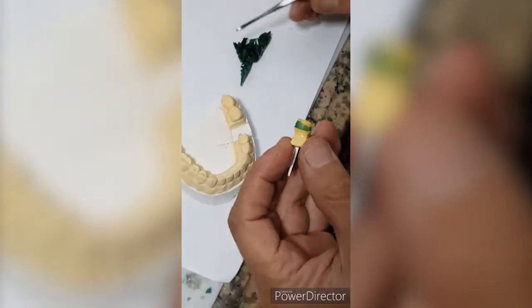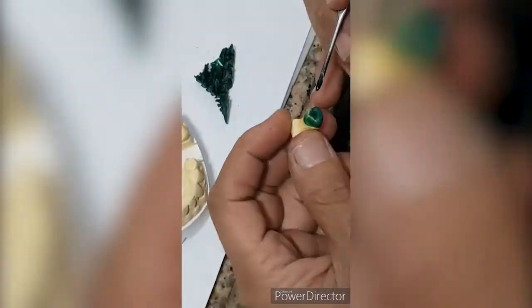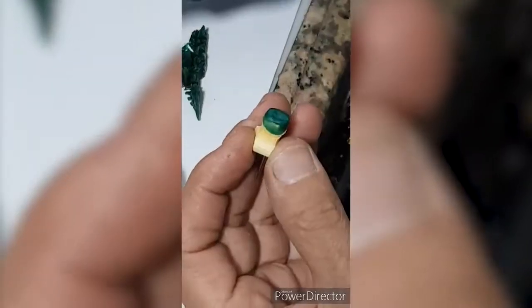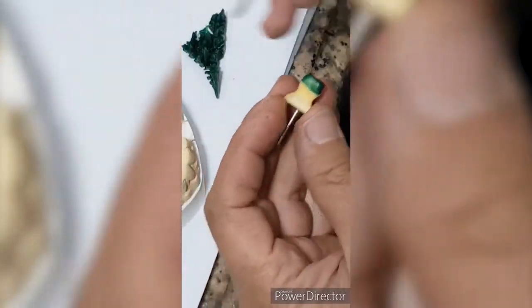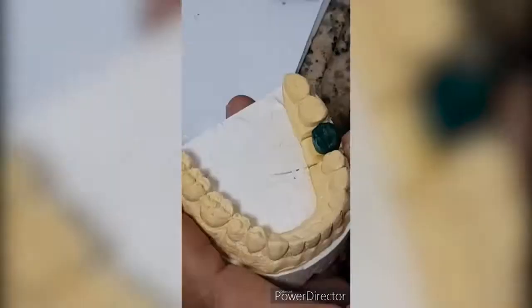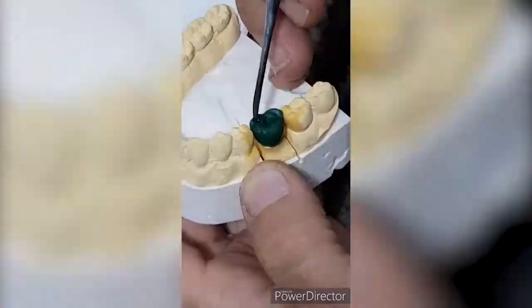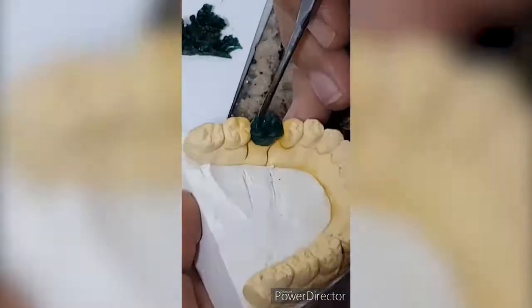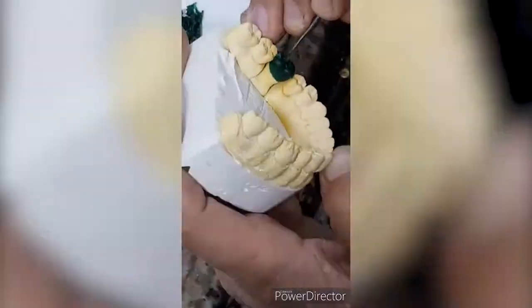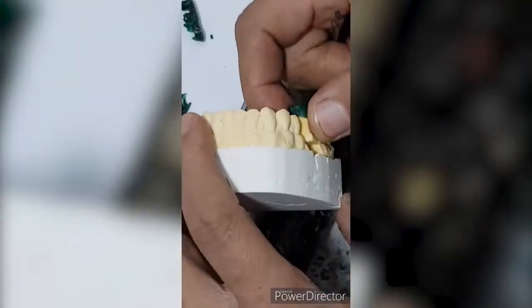Gently place the wax on the tooth and start anatomy building. Curving the wax is essential for aesthetic and anatomic considerations.